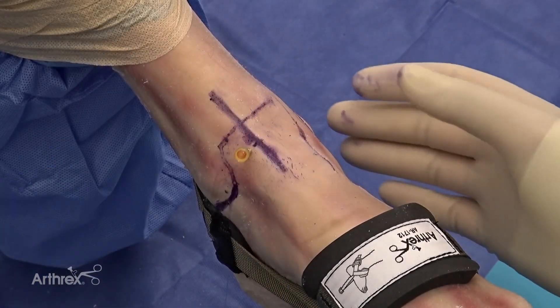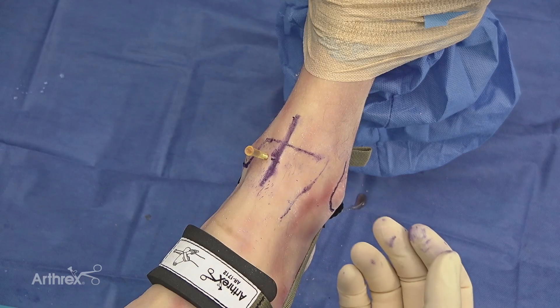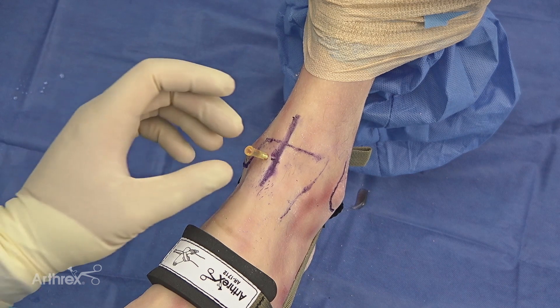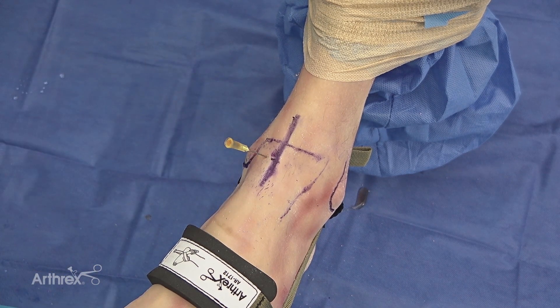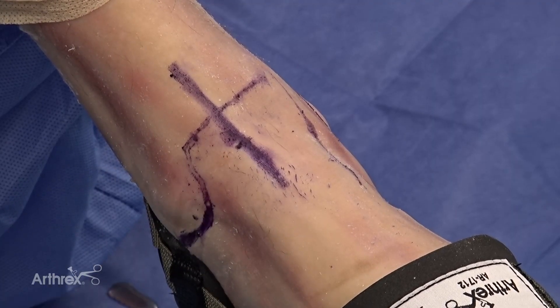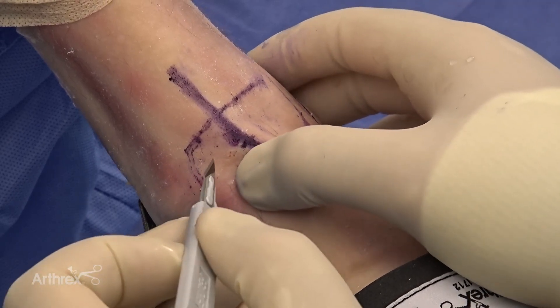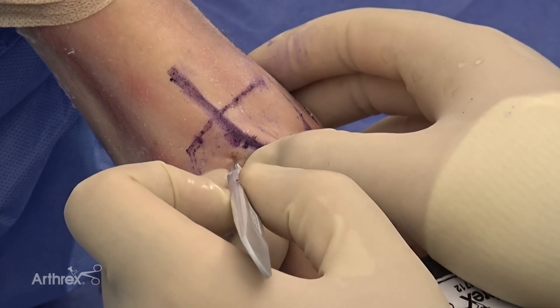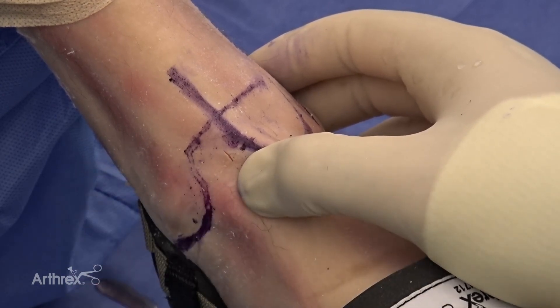Once I've found my portal placement for the anterior medial portal, I'll create a crosshatch to help identify the site of the anterior medial portal. As I pull the needle back, that will be the site for my incision of the anterior medial portal. I'll then pull the needle out.